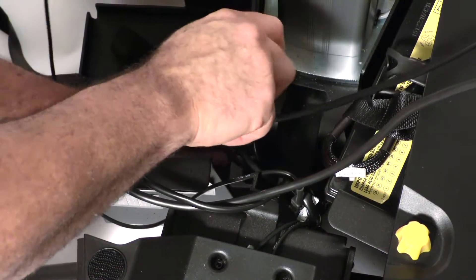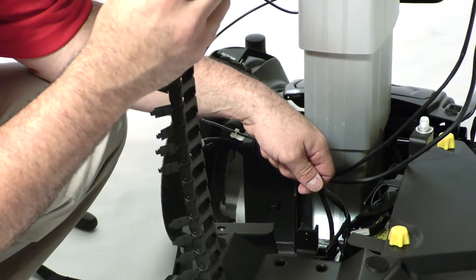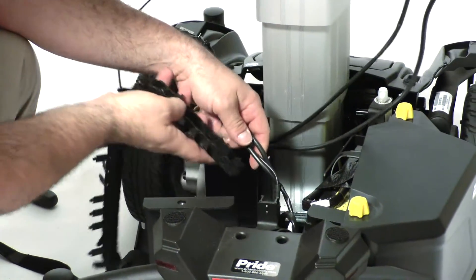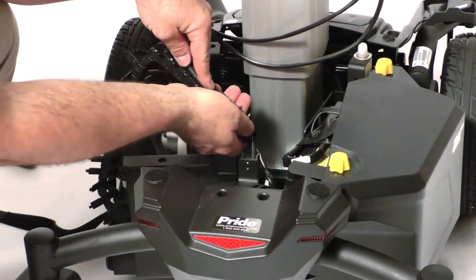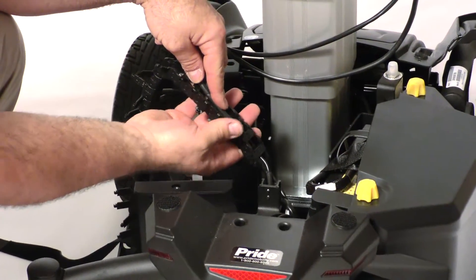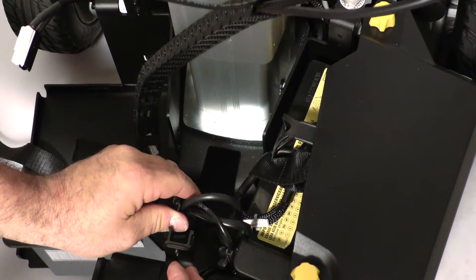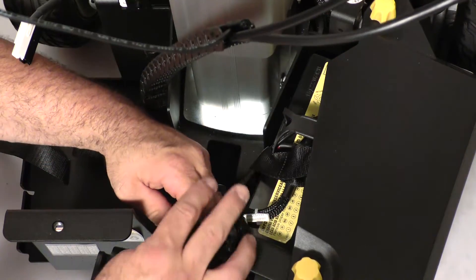Reattach the clip back to the frame and just tighten it down. Now you can begin to feed your harnessing back through the igus chain. Make sure all your harnessing is in there and together, including the harness for your air button. Just start clipping them one at a time, making sure you have enough slack so it's not too tough getting it back in.